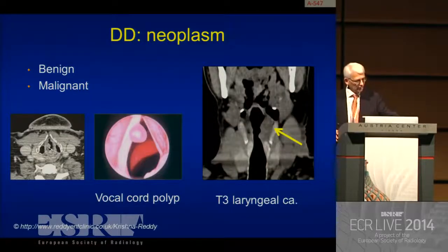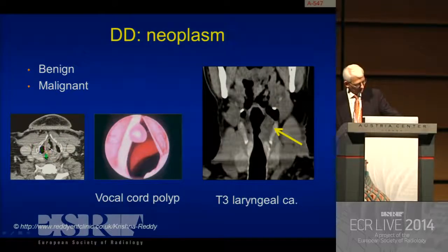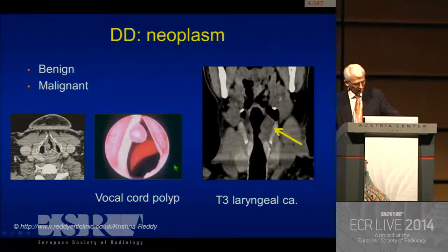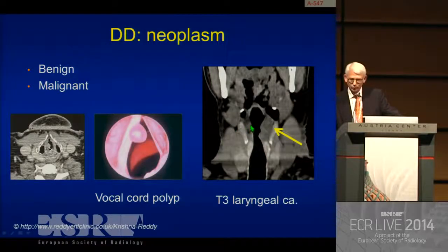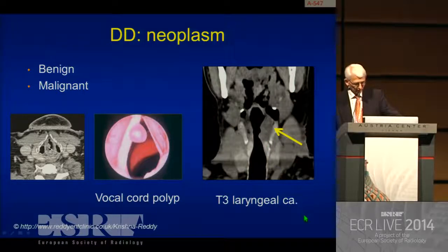Just some imaging examples. This is a CT scan at the level of the right true vocal cord — you see this benign vocal cord polyp, and this is the endoscopic view. This is a benign lesion causing hoarseness. And this is laryngeal cancer. Normally in the coronal plane, we see the muscular density of the true vocal cord, and just above it, more fatty density of the false vocal cord. Here you see an infiltrating lesion involving both the true cord and the false cord, so you can imagine that this cord is not moving normally.